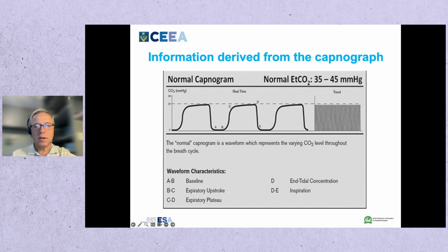This difference is increased if there is a mismatch between ventilation and perfusion of the lungs, as seen in patients, for example, with lung diseases, pulmonary emboli caused by thrombus, air, or fat, low cardiac output states, and hypotension.